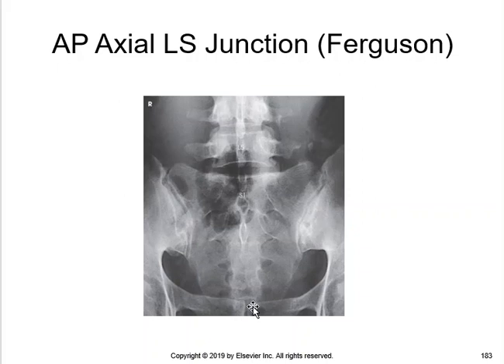Notice that you've got the anterior pelvic bones projected higher on the sacrum. On a KUB, really you see the coccyx right down here, overlapping the very upper portion of the symphysis pubis. But you got a significant portion of the sacrum over the symphysis pubis.